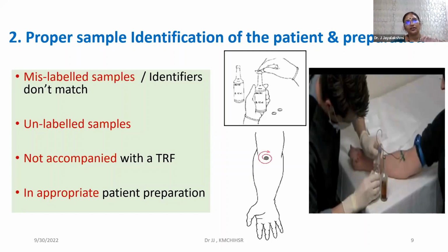So your cleaning would be with 2% chlorhexidine if that's your policy that's written down. And if you're going to use a swab, circular, and you clean it for 30 seconds and then discard, take another swab, clean it 30 seconds and discard. And then, you also collect the sample, appropriate amount of sample. So that's another thing. But here, preparing the site for the sample collection, very, very important.